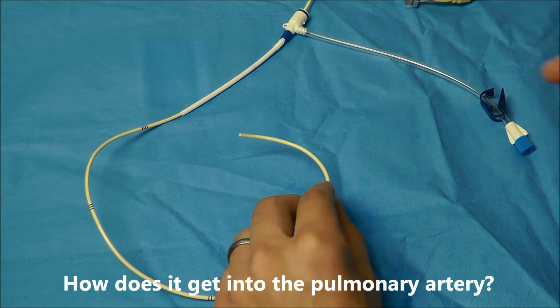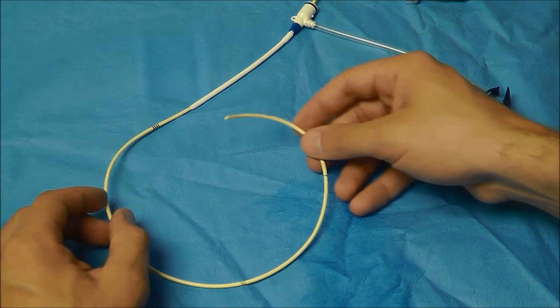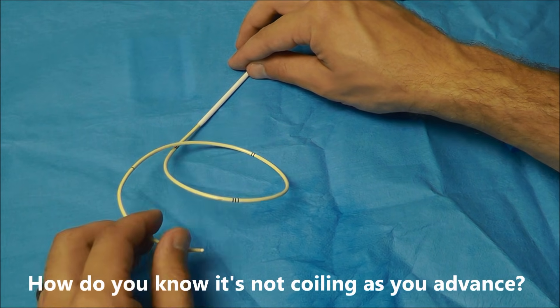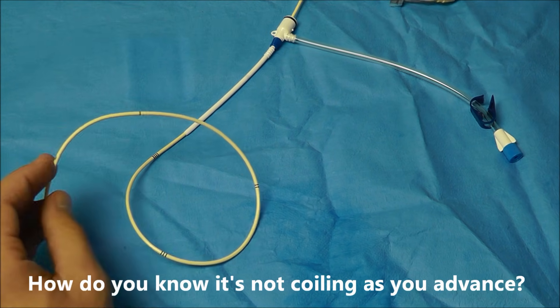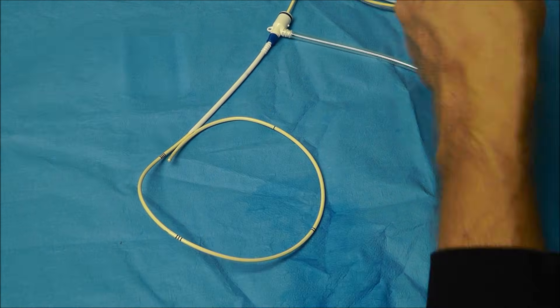So the first question you're probably going to have is how does this actually get into the pulmonary artery, and what prevents this from coiling up like this in someone's atria or ventricle? And the answer is this balloon on the distal tip that I'm going to inflate here.